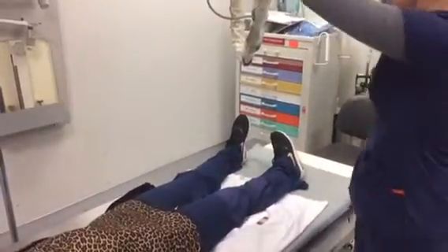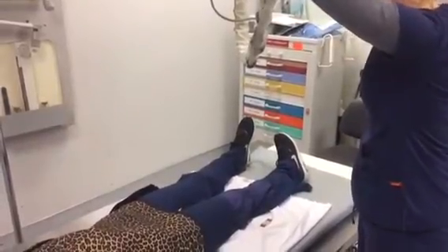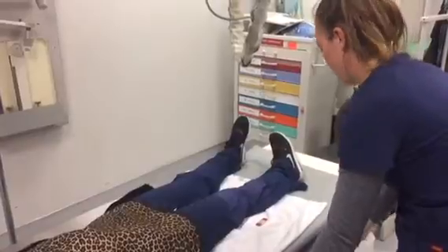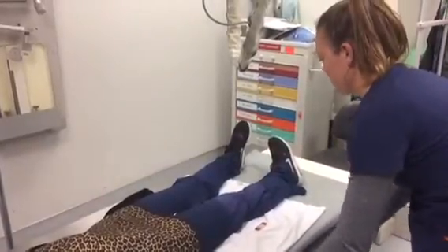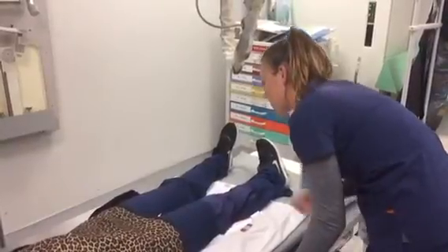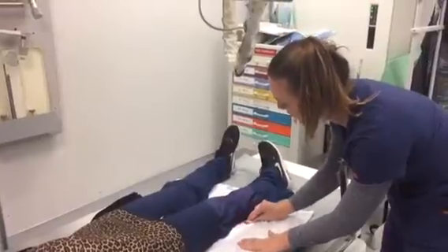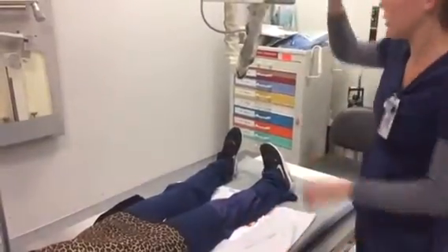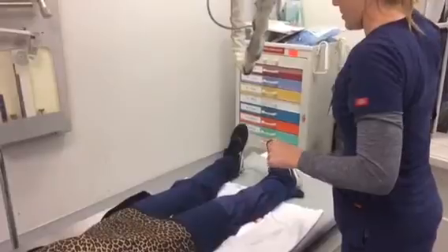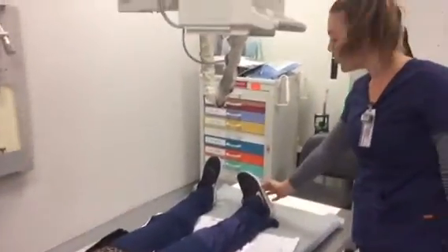I also will collimate on both sides and down. Making sure that my image is also correctly marked. The internal oblique rotation. Okay, same technique, X-ray.